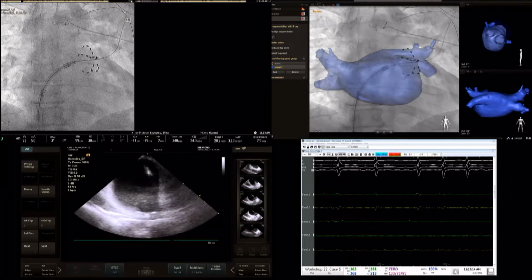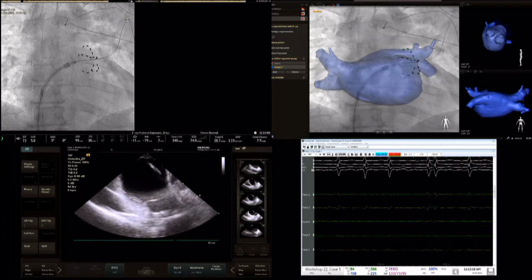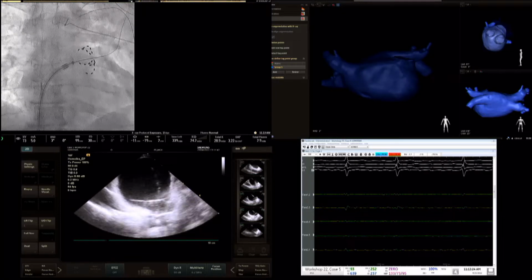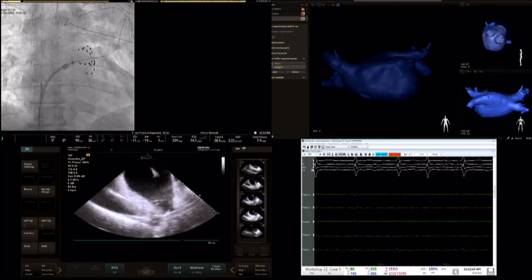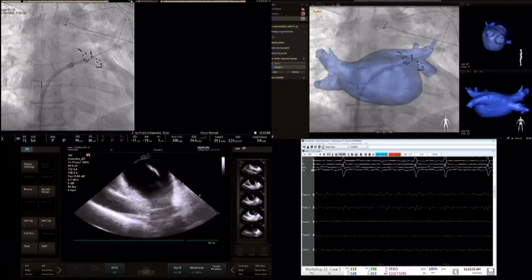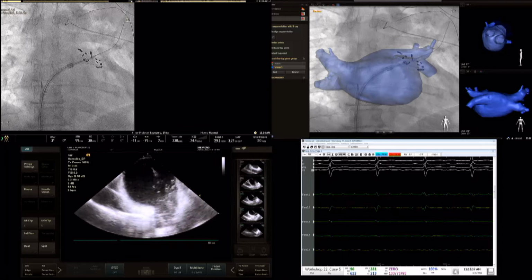And there are only far fields. So actually, we probably can say that even with left common, we don't need to apply any other energy. With the flower, it's changing. Not really. Okay, so I think if you agree, I will stop here for the left, and we will move to right.